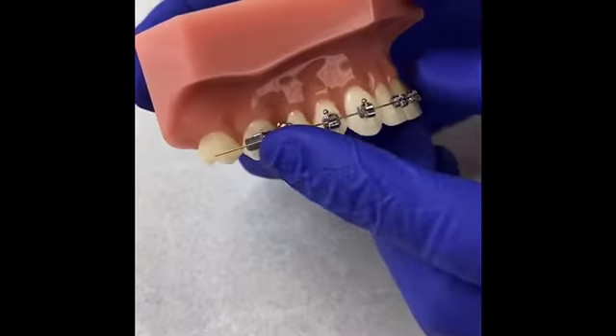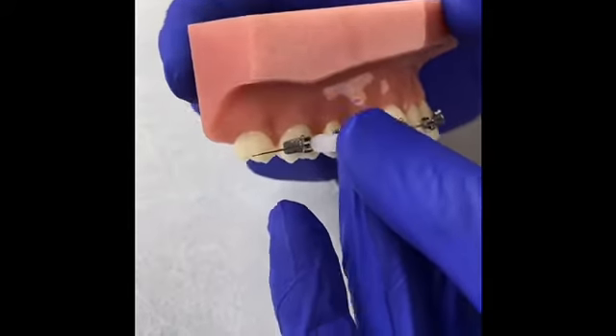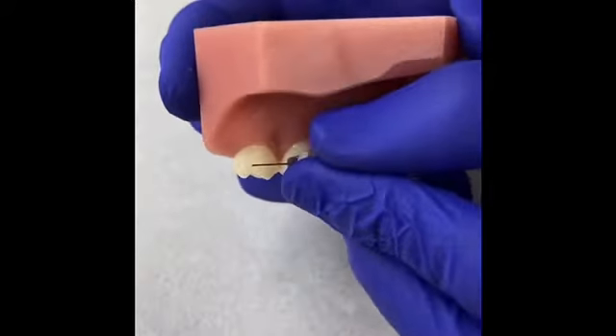If it's a back bracket, it's a little bit more challenging to get to, so we recommend you just take a long piece of wax to secure the bracket both in front and behind the one that's loose.